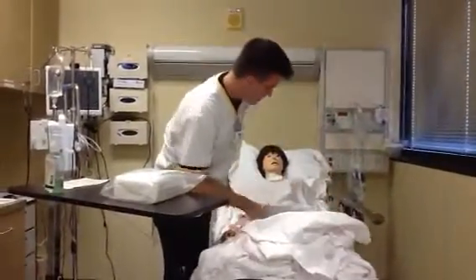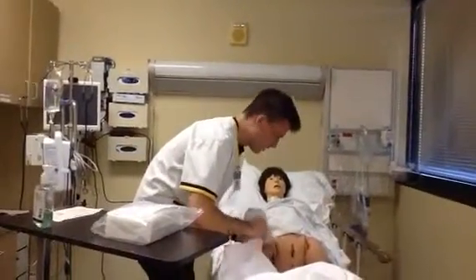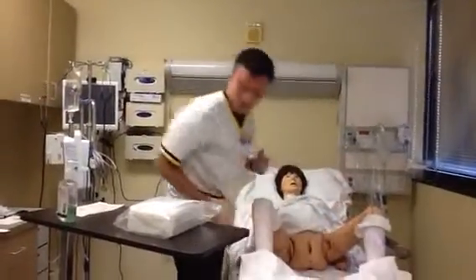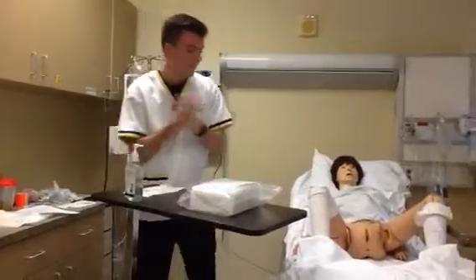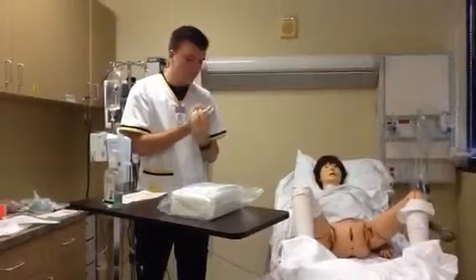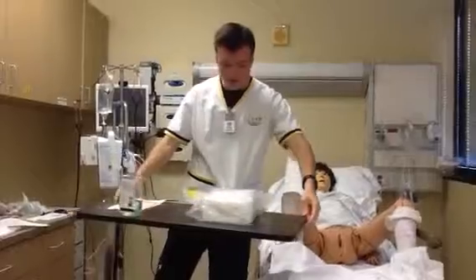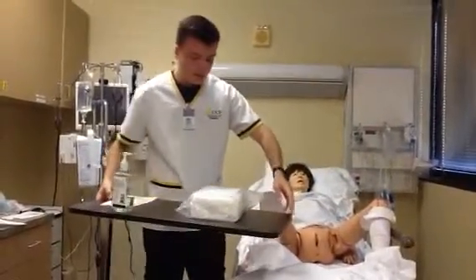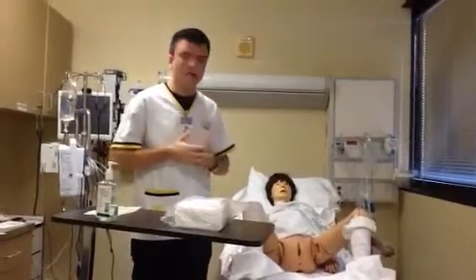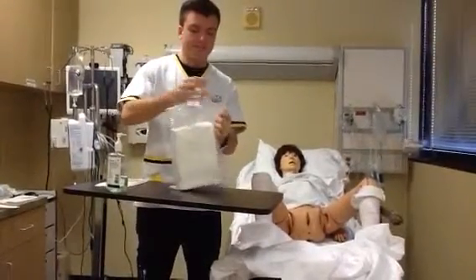So I will lower the side rail, and I will get Mrs. Knight in position here. Going to put her leg out. Since I've been touching the patient, I will perform hand hygiene. And at this time, since I'm about to begin the sterile procedure, I will make sure that my bedside table is properly aligned to the right height, and I'll make sure that I am in a position to where I can always keep it in front of me at all times. Alright, we are ready to go.